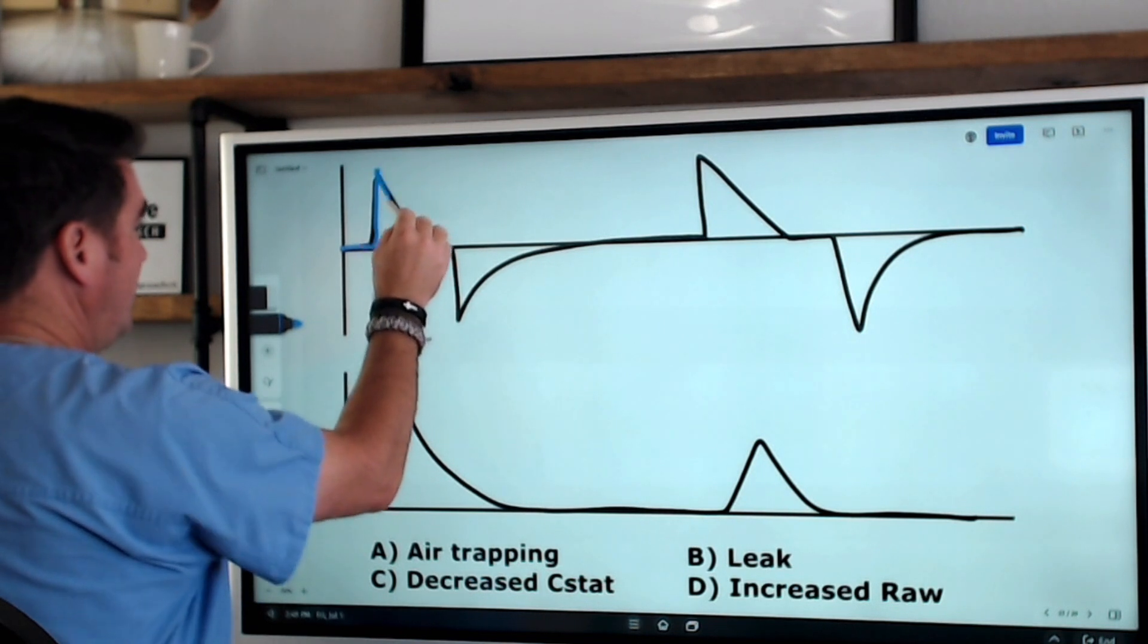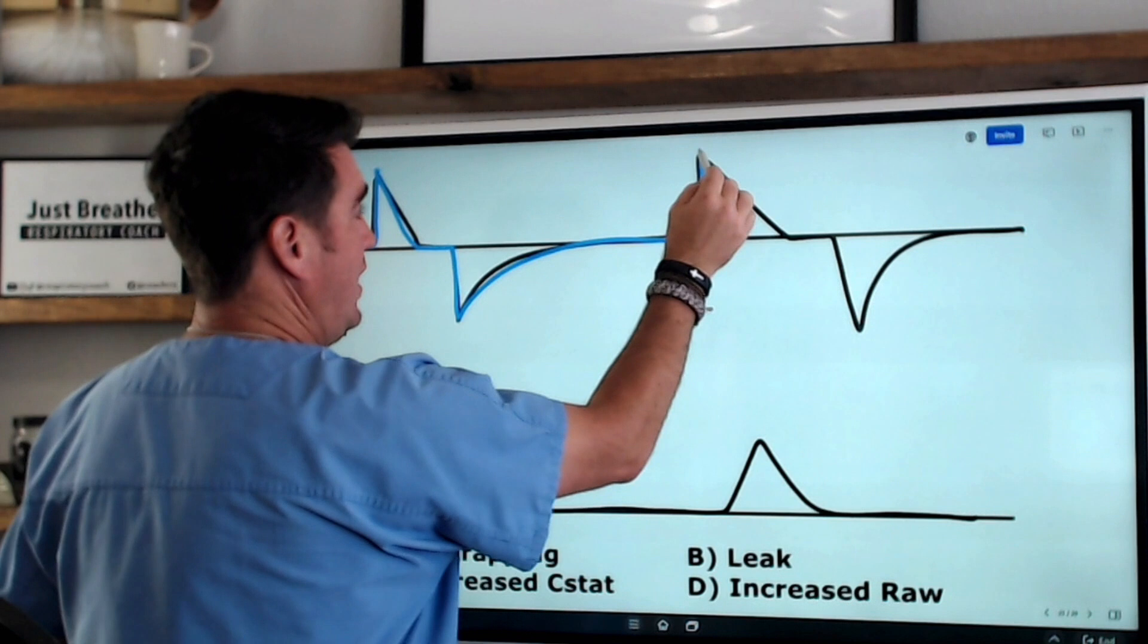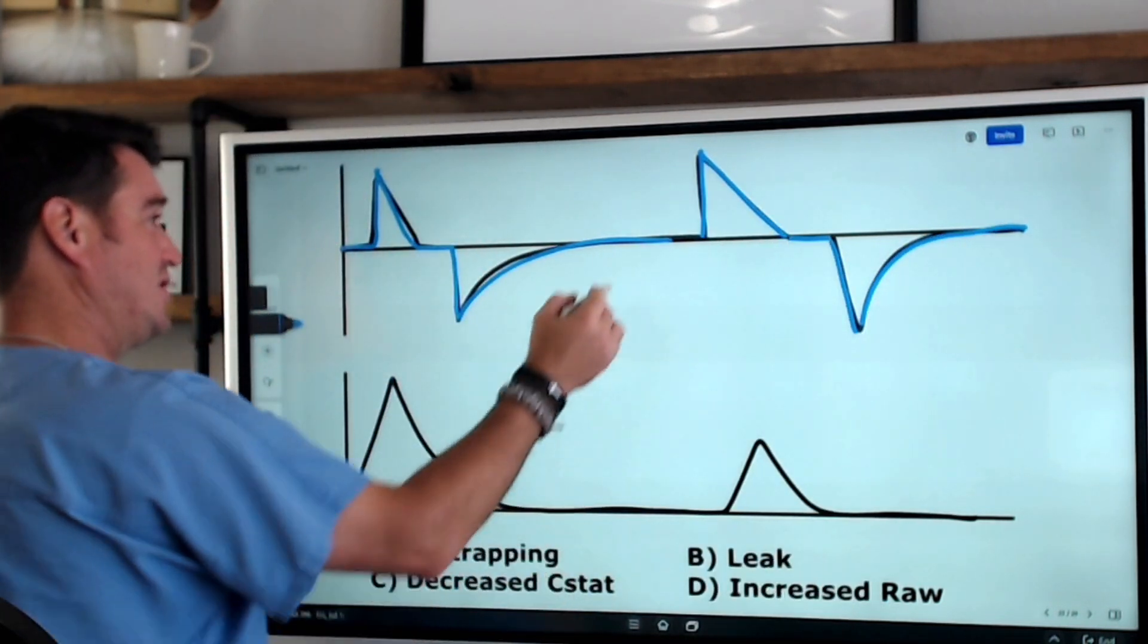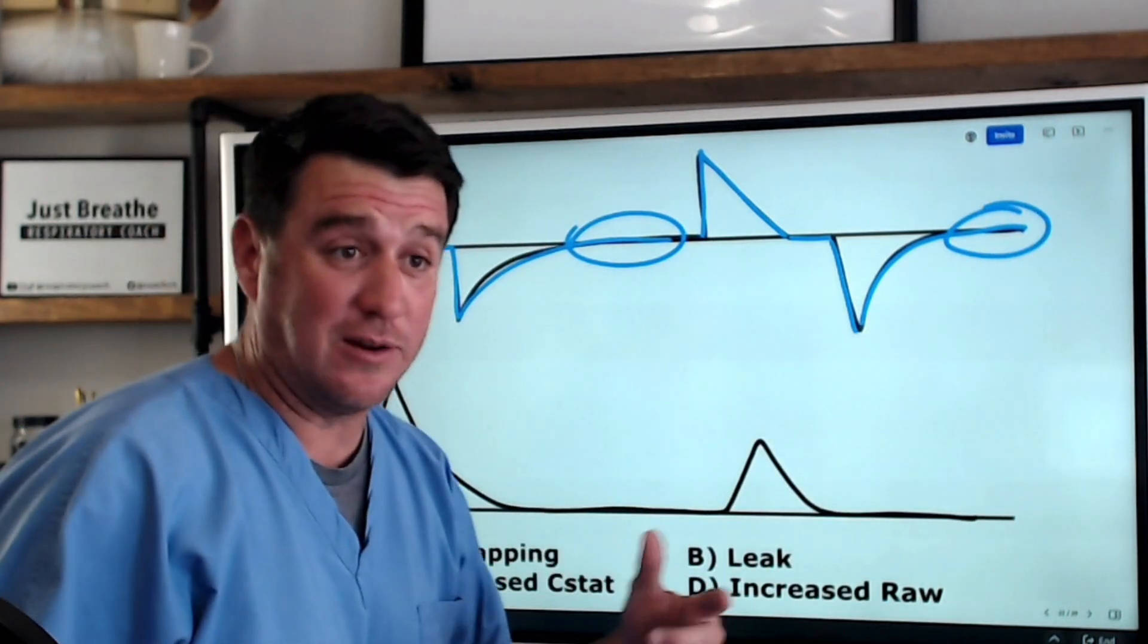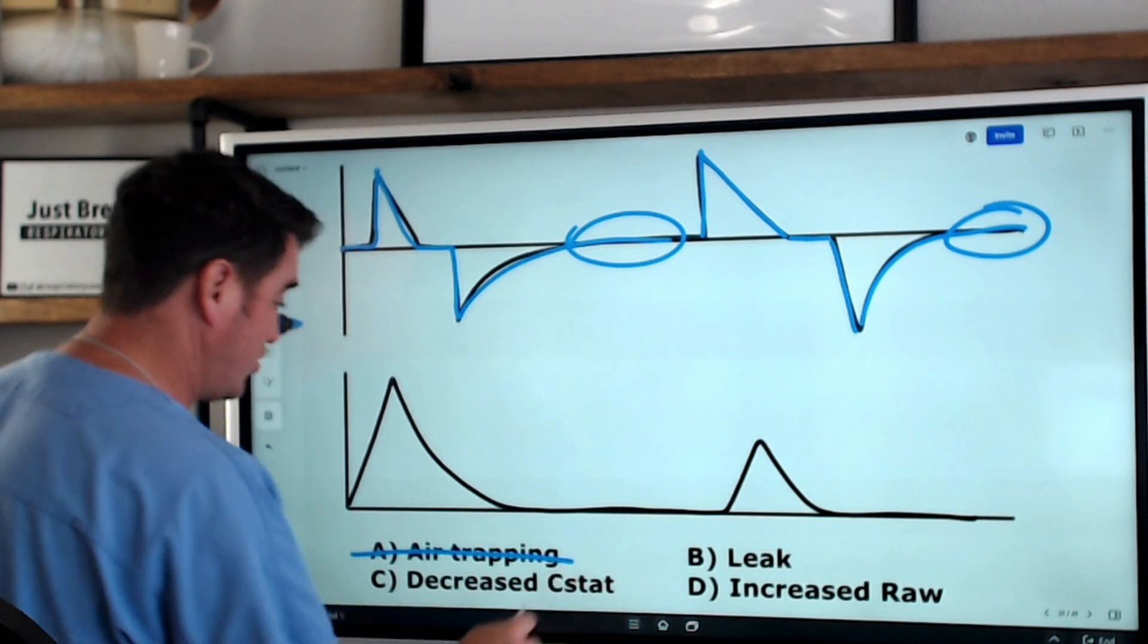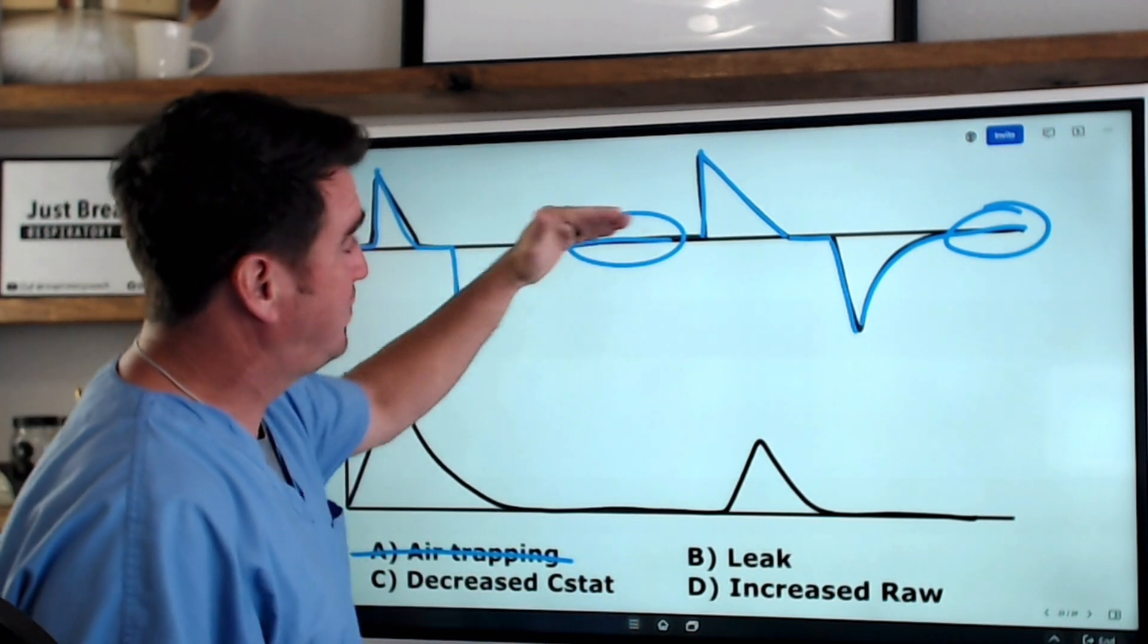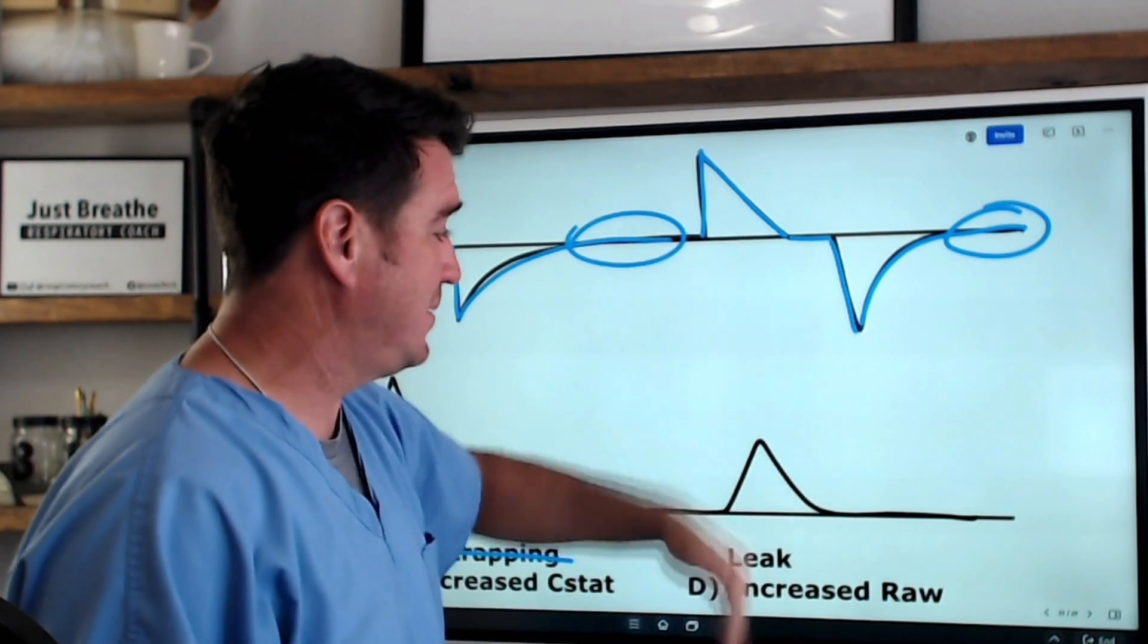Flow waveform, up, decelerates, back to baseline. Up, decelerates, back to baseline. Interesting, back to baseline, back to baseline. We can come down literally right now. Right now, we could come down and eliminate air trapping. Because the flow waveform comes back to baseline. That's all it does. It comes back to baseline.